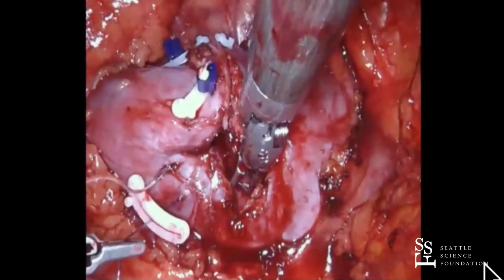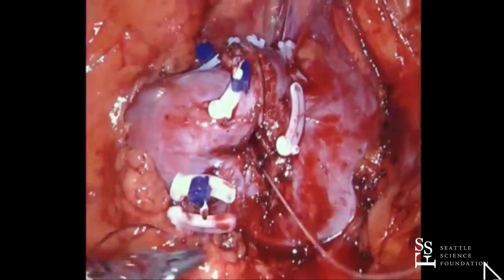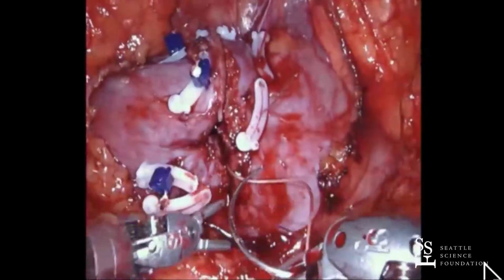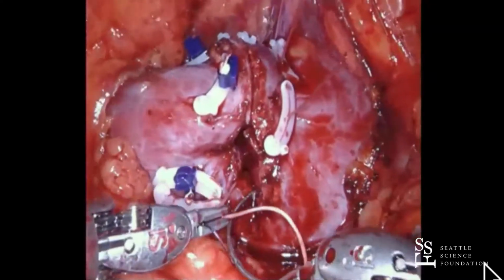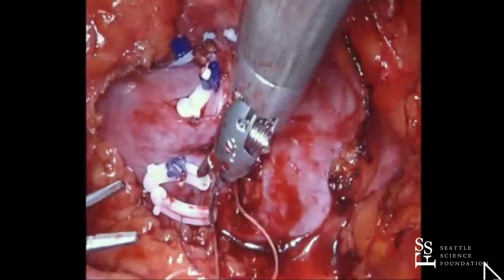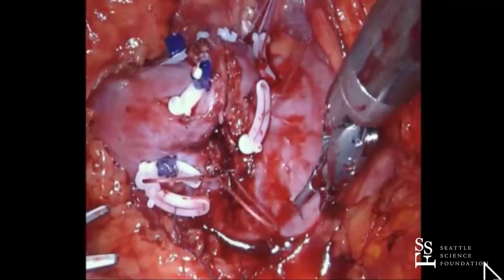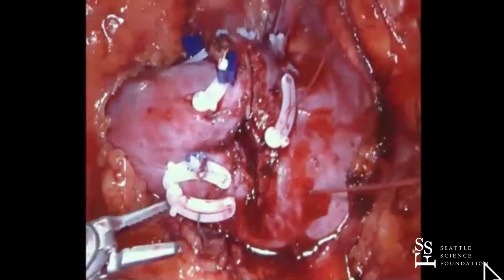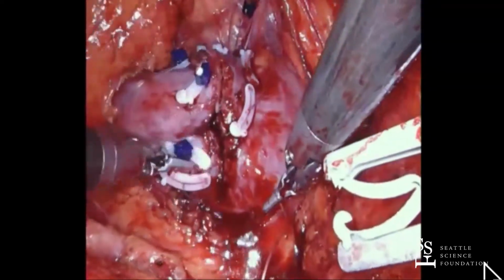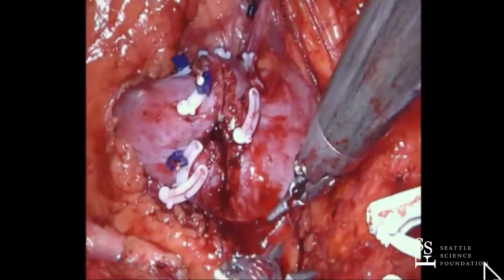4-0 was the first layer. 3-0 was the second layer. I wouldn't remember any of it because everybody's got their own method, so I'm not sure this is reproducible. I think everybody's got to find what they like. There are some basic principles that you want to try to adhere to, but I think the key is the first layer, the 4-0 layer, that's the one that does the most good in my world.